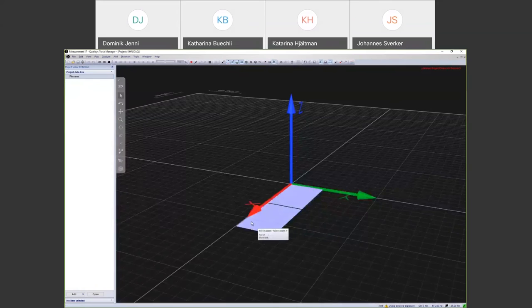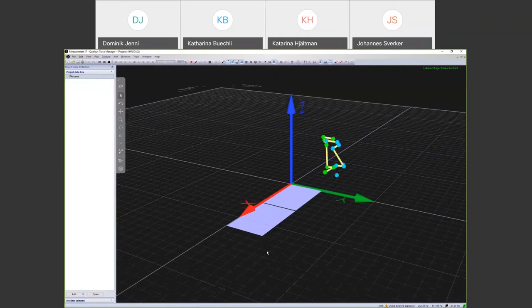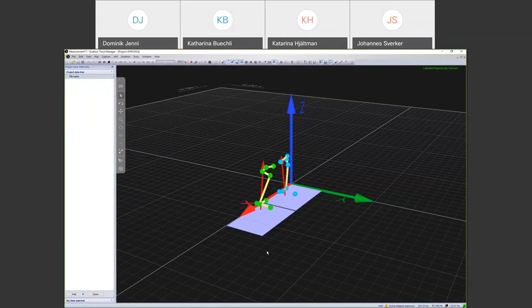In live view, the two force plates are visible. Katarina has markers on her two legs, and when she walks on the force plates, you can see the force arrow indicating the force being applied. This data can then be captured or streamed in real time to other programs.